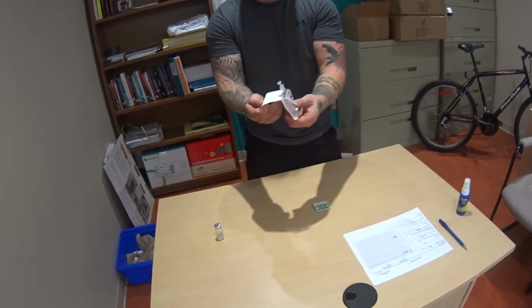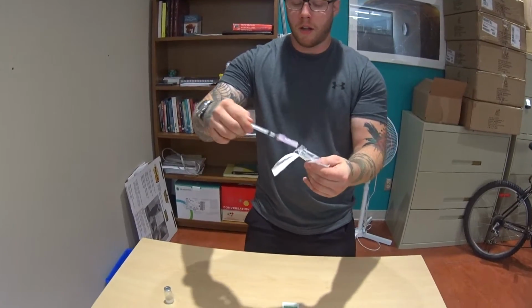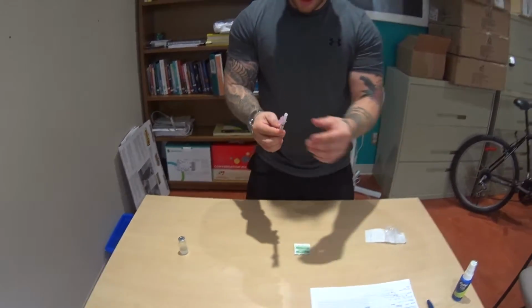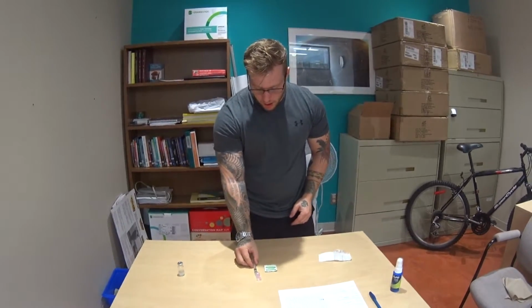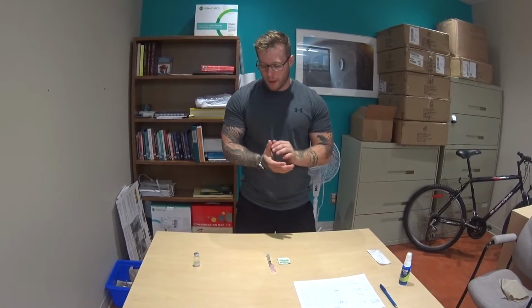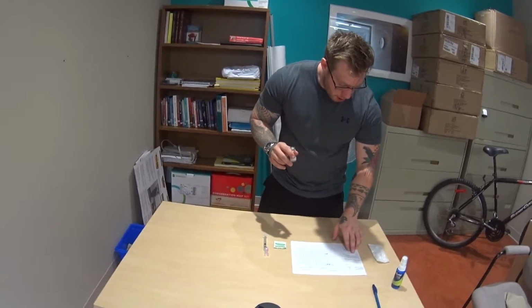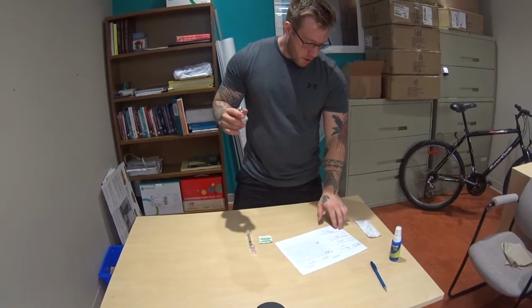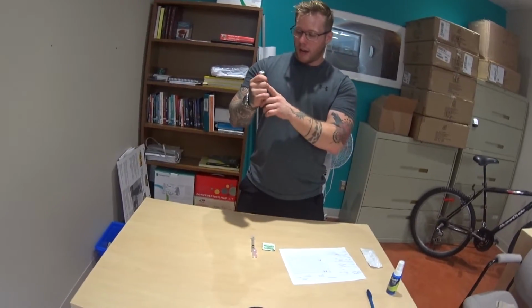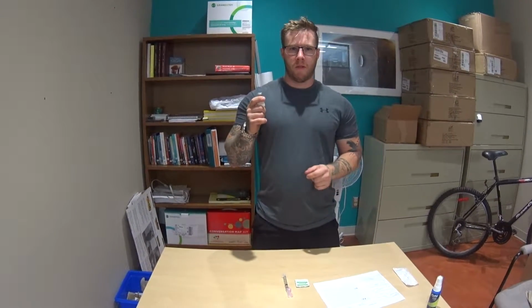I'll just prep my needle and syringe for my next step. I'm going to pull it out, ensuring sterility. I'm going to pull out the syringe and lock it on to the needle. Perfect. I'll just set that aside, ensure it's locked. Awesome. Before I do anything else, I'm just going to perform my second check. I'm going to ensure that I have Joe Milton. Again, Joe Milton, haloperidol Haldol, 2.5 milligrams IM injection, and this is 5 milligrams per 1 ml. We need to give 2.5 milligrams, therefore we need 0.5 ml. Perfect.